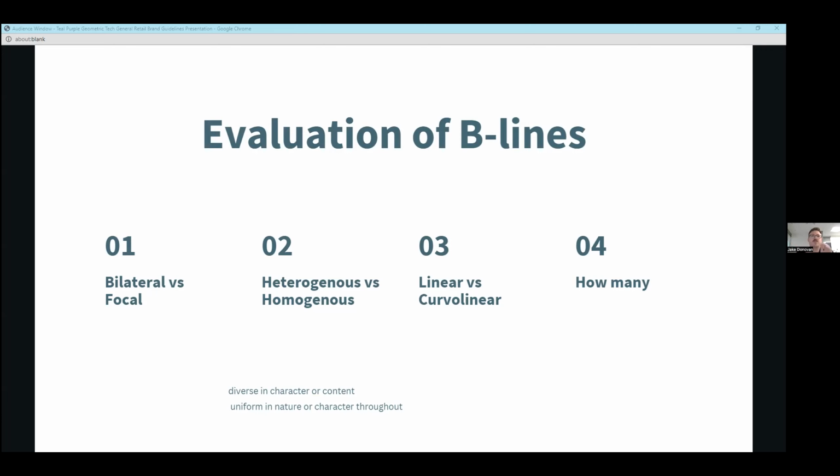Thirdly, there's which kind of probe you're going to use. Now, I don't think we talked about this yet, but again, this is one of those things where you get a lot of difference of opinion.